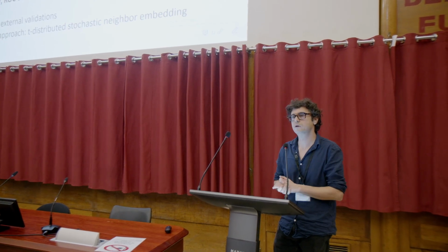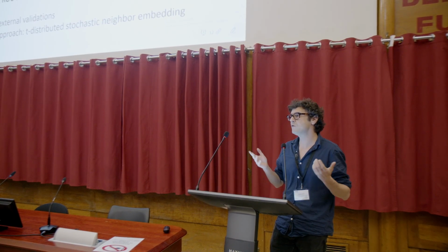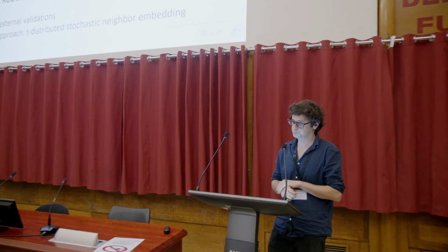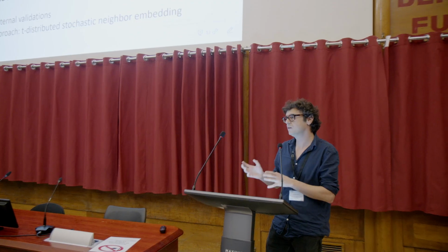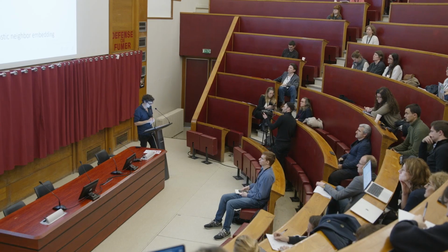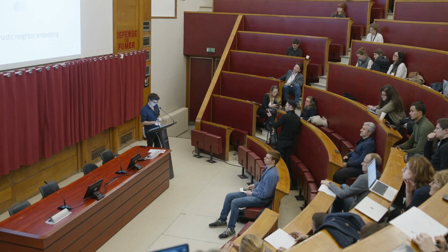And then you build contingency tables. But the first problem, let's say, is that it's not a 2-by-2 table because we have 11 diagnoses that are possible. So it's an 11-by-11 table. And because of that structure, you cannot calculate sensitivity and specificity, but we decided to calculate class-specific estimates of sensitivity and specificity, and also we could draw ROC curves. We conducted internal and external validations, and also a graphical approach.